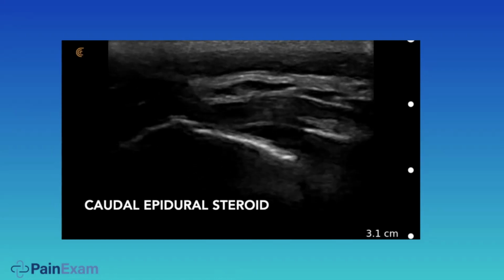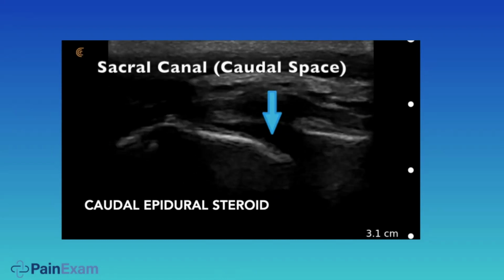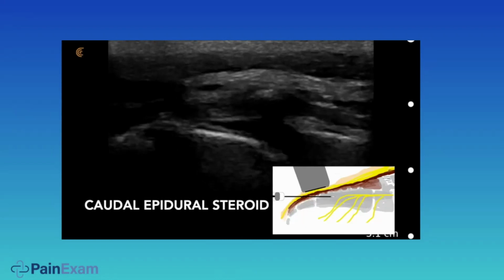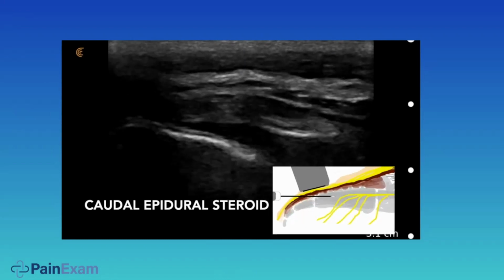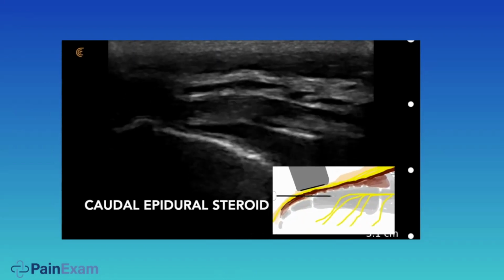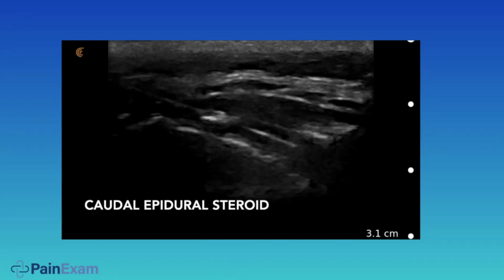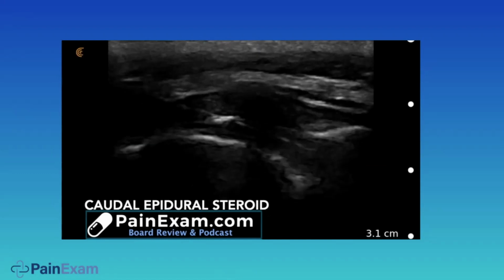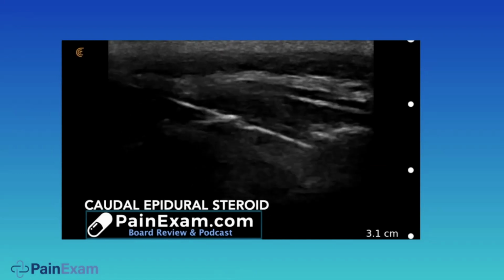You'll note here the needle touched the bone of the canal, and I'm redirecting. I'm increasing my angle and perforating the ligament into the epidural space. I'm going to aspirate and inject, and it's a nice procedure, very safe. You see some retrograde spread backwards.